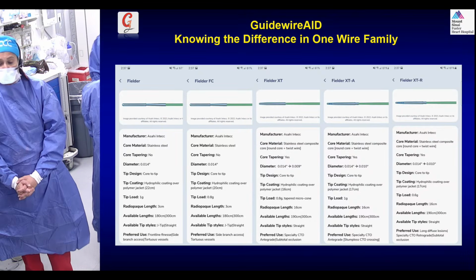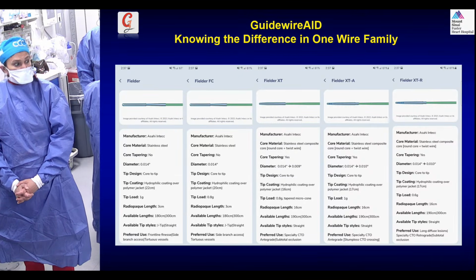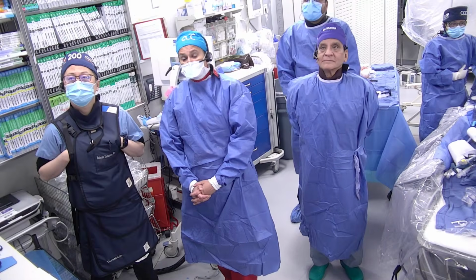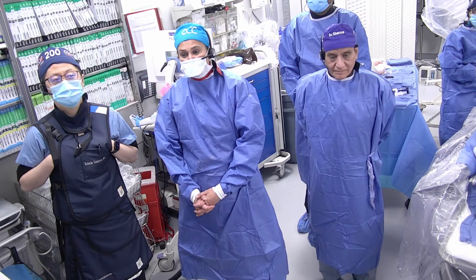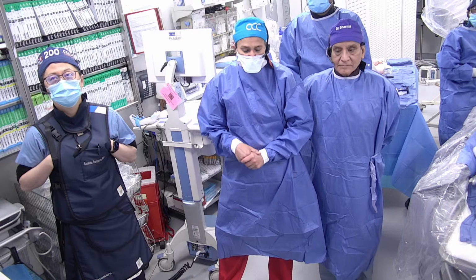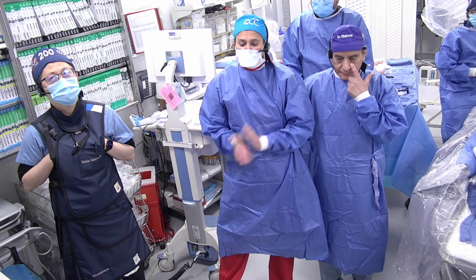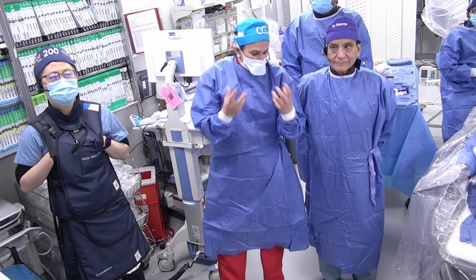And in the end, what I need to say, let's go back to the full slide. As a part of our training, if you want to continue doing intervention, we have to train ourselves. So train your eyes and use your eyes. The eye is the key. And second important, I keep telling all fellows that when they come and work with me, no torquer. We need to use our God-given sensation and train your fingers so you're able to wire and take care of any complex lesions. So train yourself, your eyes and your hands.